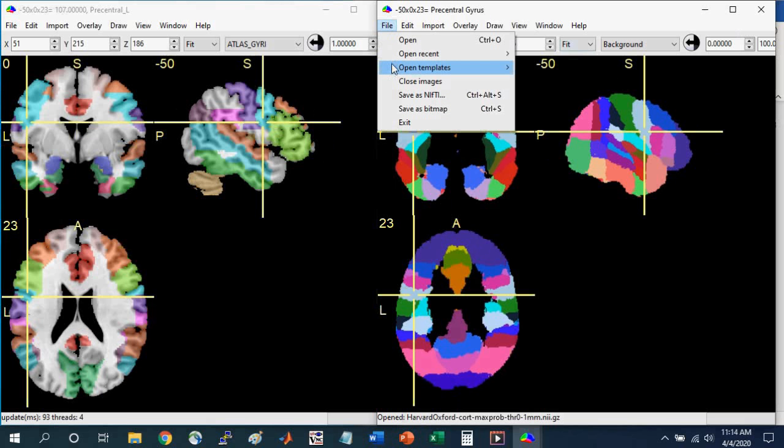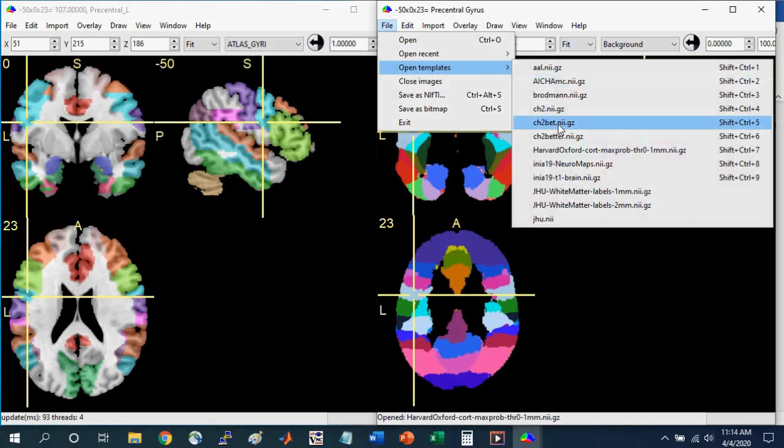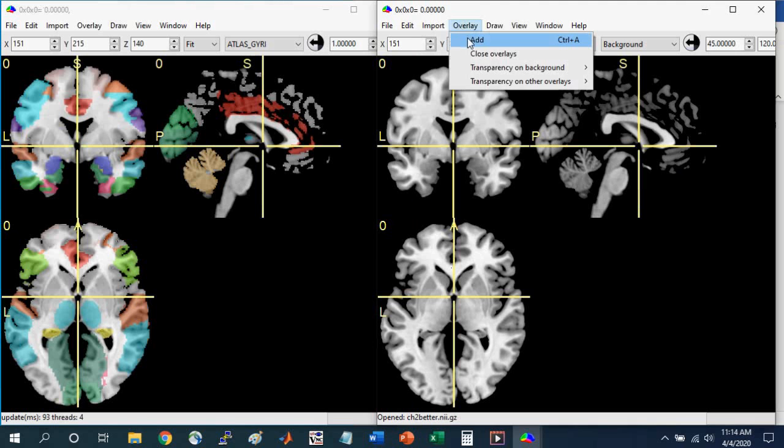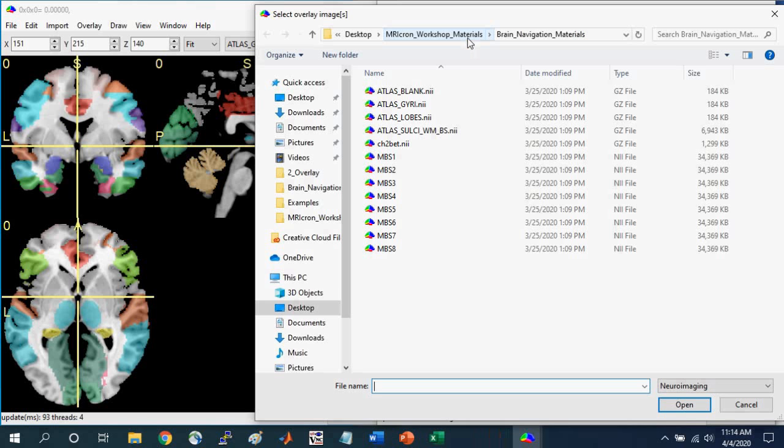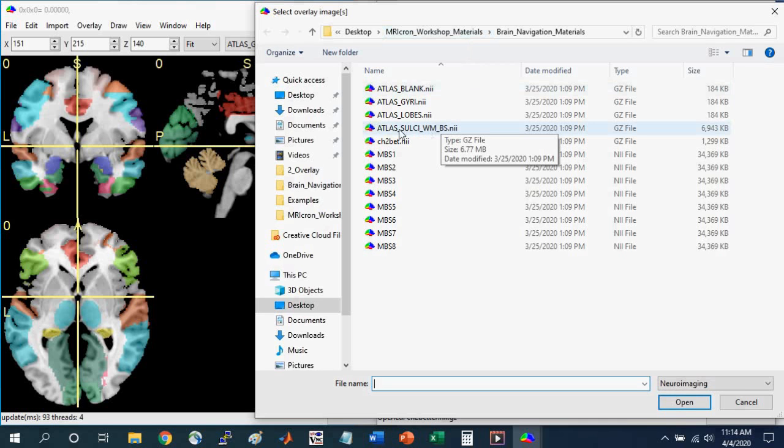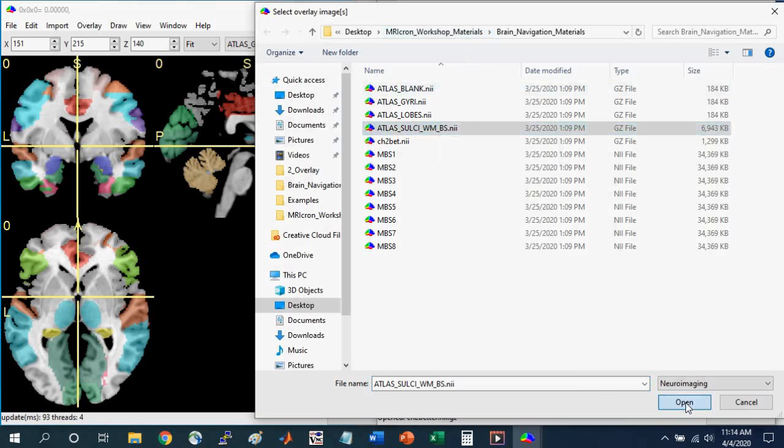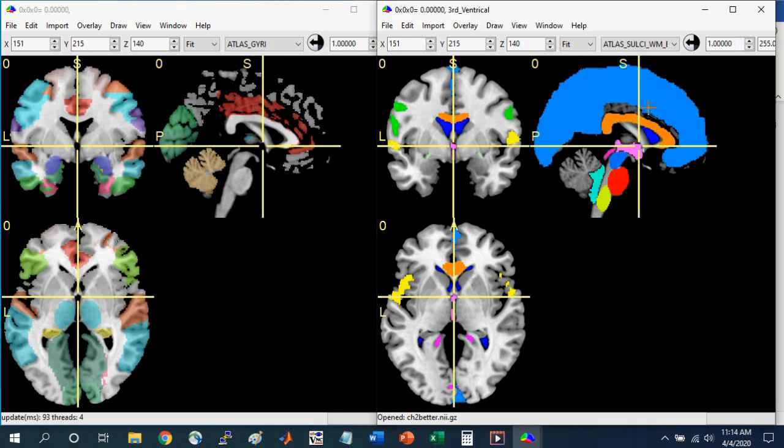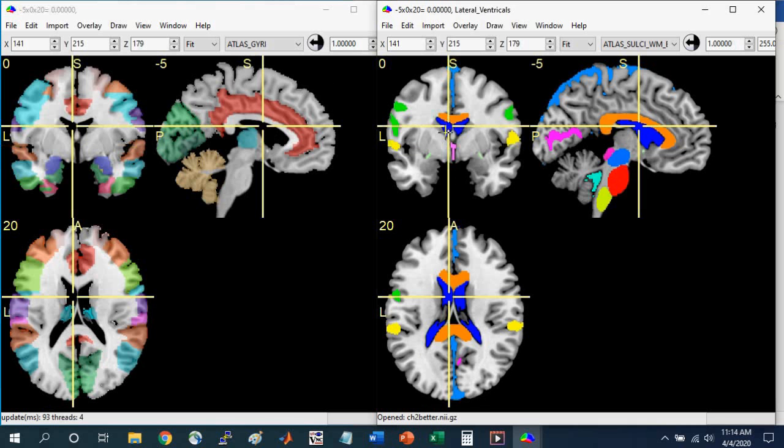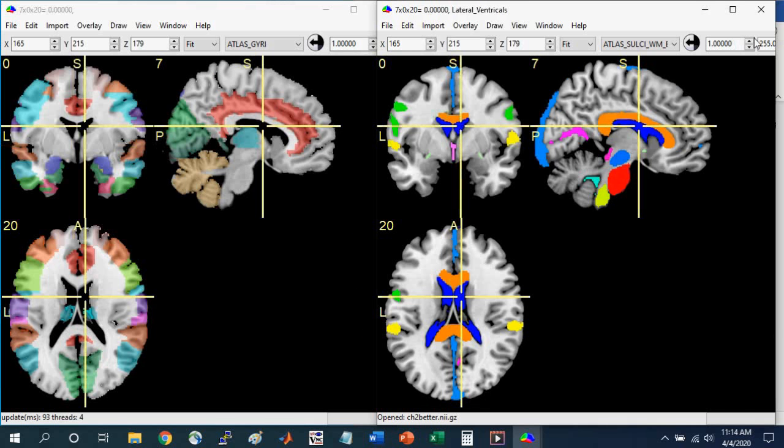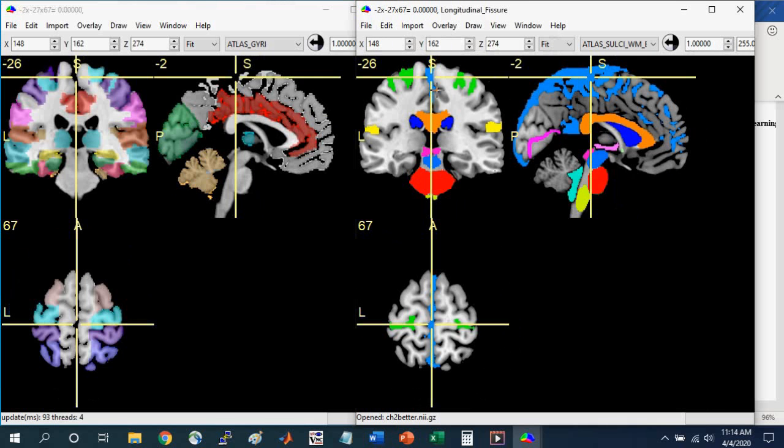So I'm going to open the template again. So go to Open Template, CH2 Better. And I'm going to Overlay, Add. And I'm going to add the last atlas that has labeled structures in it. It's called Atlas Sulci WM for white matter, BS for brainstem. Click Open. And we'll see that this has different structures than what you see in this Gyri atlas. So this has the ventricles labeled. So here in blue are the lateral ventricles. And it has the sulci and fissures labeled. So here's the longitudinal fissure.